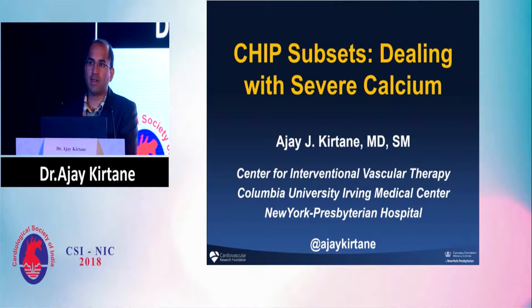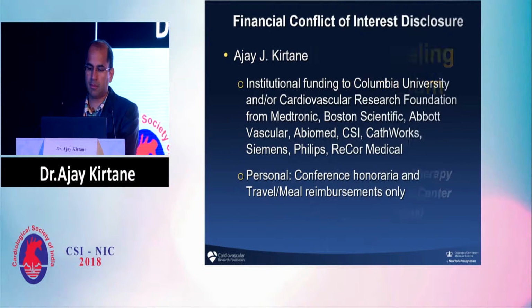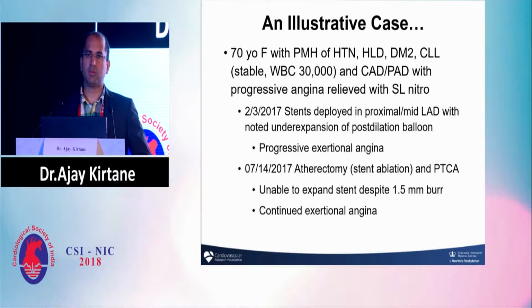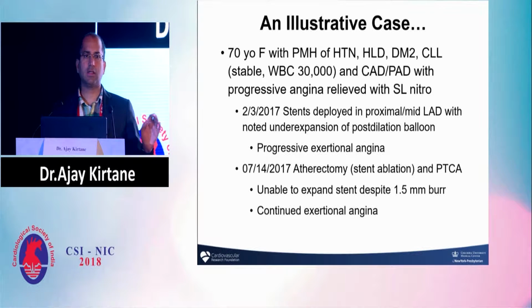Perfect. And so that's a great segue to talking about calcium, and I'll talk a little bit about dealing with severe calcium and this issue that comes up in all of these CHIP cases as a whole. This is just a case to start off with of a woman who had typical symptoms, had her LAD stented, and unfortunately at the time the stents delivered fine, but there was difficulty expanding the stents.